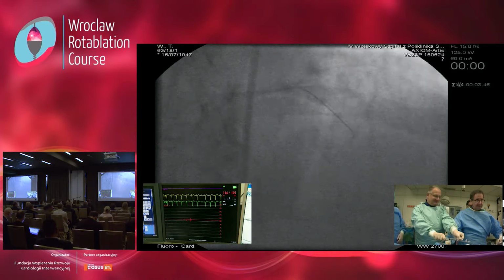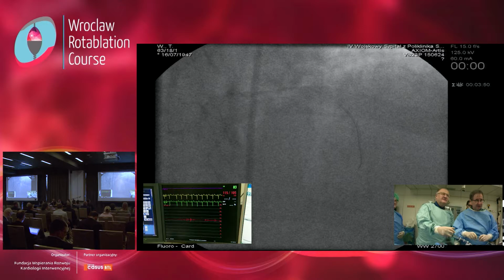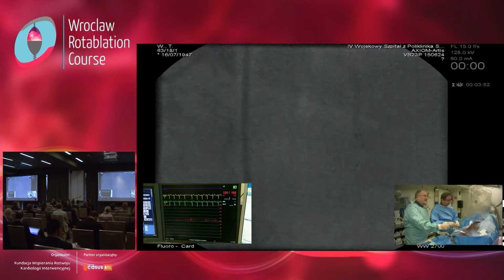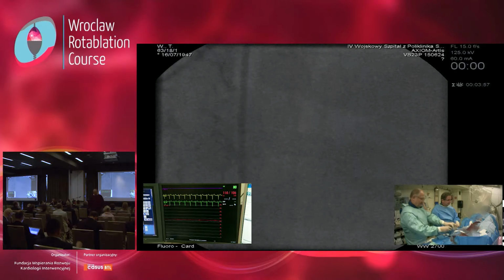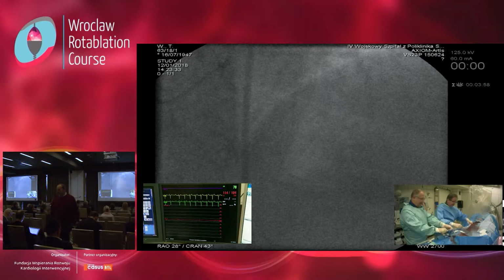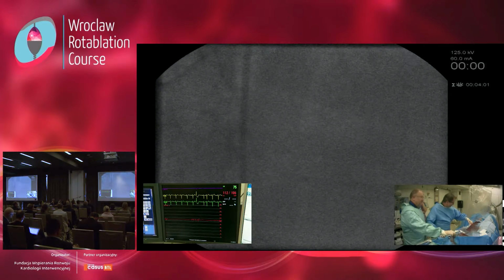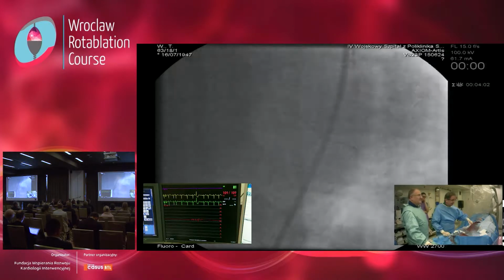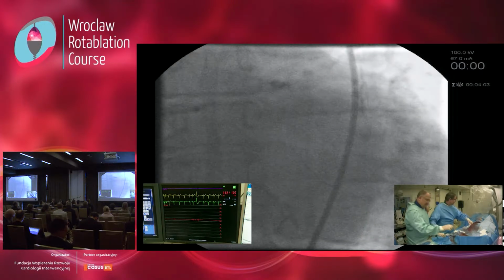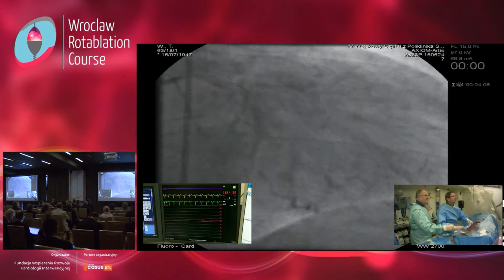So it's going very nicely. Check. So we are now, you see, we spent just a few seconds to go to, but we have a patient who is not really slim, so that's a small problem here. So now it's probably better.